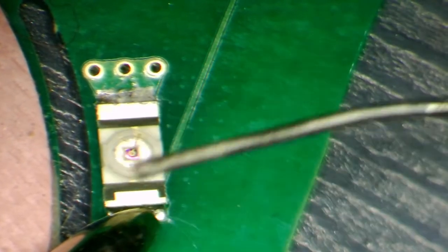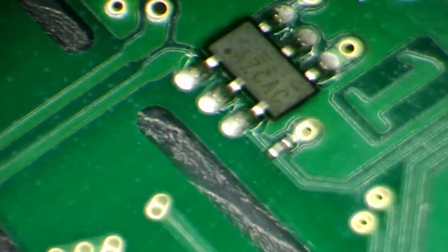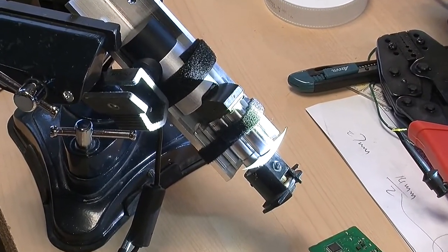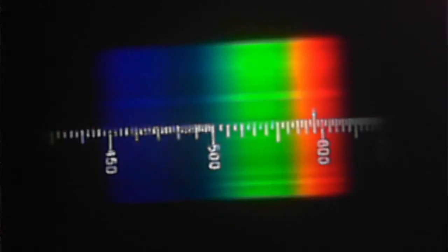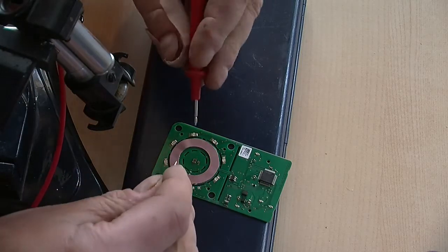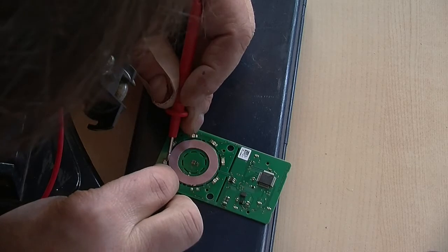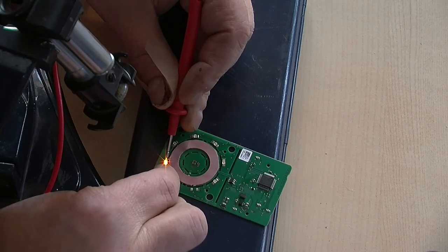And that would tend to point towards less likely being fluorescence and more likely just looking for the presence or absence of a particular color in the illuminated goop. I'm going to do one more test. I've set up this little spectroscope, and I'm going to do a video about that some other day. I'm going to use it to look at the spectrum of the light from one of these LEDs and confirm whether it is indeed yellow. It is of course tricky to get going like that. And yes, when I look through it, there is a very obvious yellow line, and that does confirm that it is indeed a yellow LED.